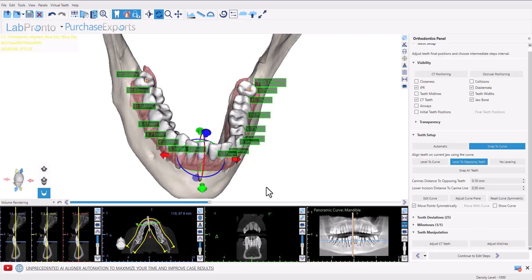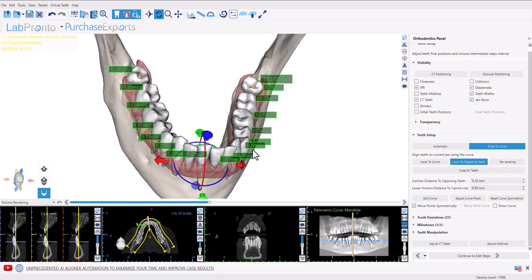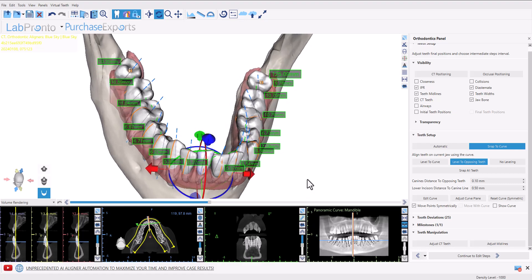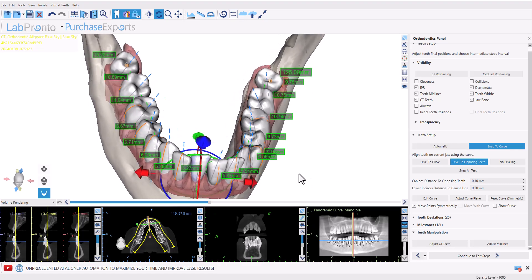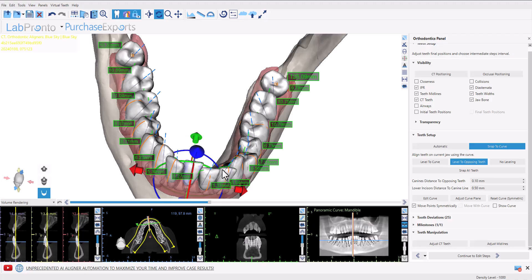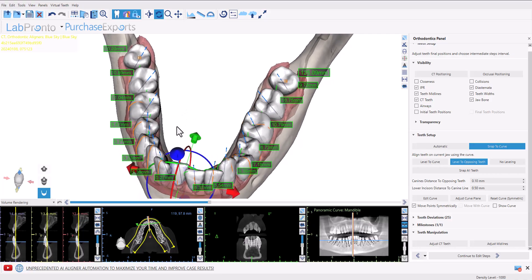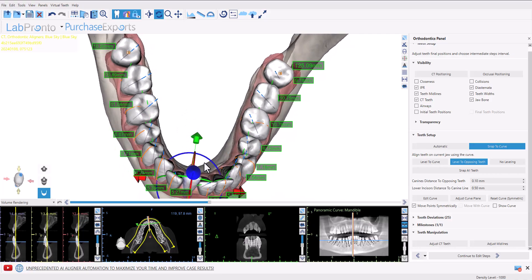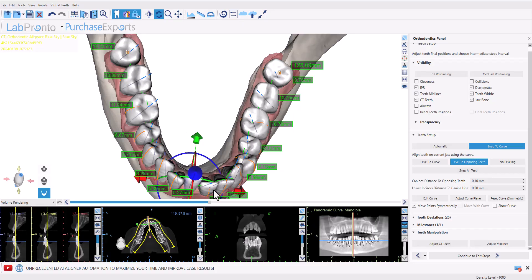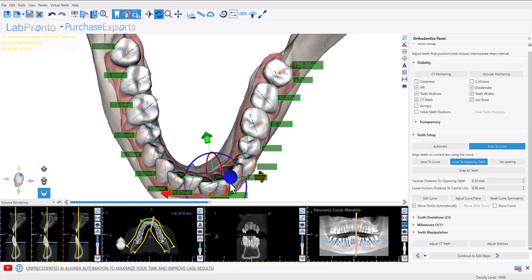The midline positioning of individual teeth can be viewed by clicking the checkbox for teeth midlines. We can now see the green indicator line on each tooth, indicating the width of the tooth and where that measurement is taking place.